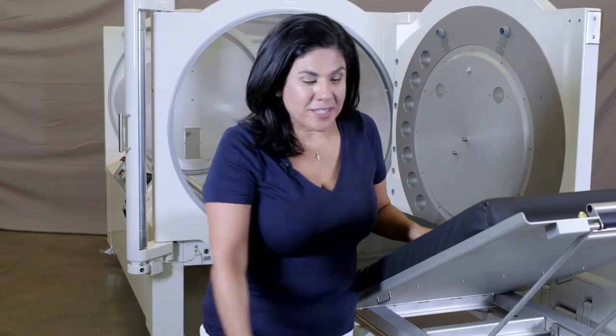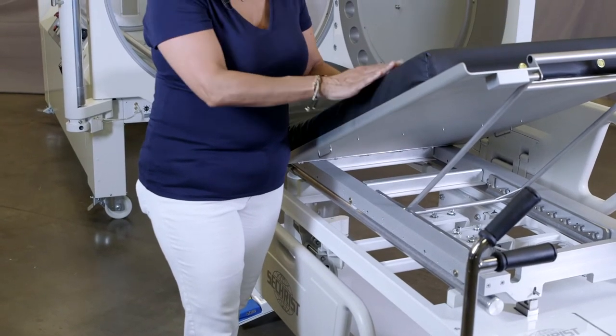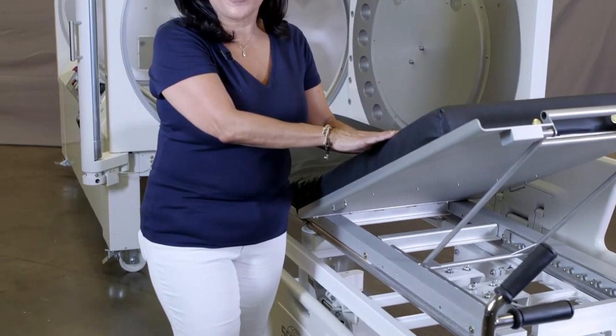Our research and development and engineering team developed the eGurney with you and your patient in mind. We wanted to make sure that we developed a product that made loading and unloading the patient as easy as possible, and for your patient to get on and off the gurney as easy as possible. The eGurney is comprised of three main components: the electric gurney base, our stretcher plate, and our omnipressure hyperbaric mattress.